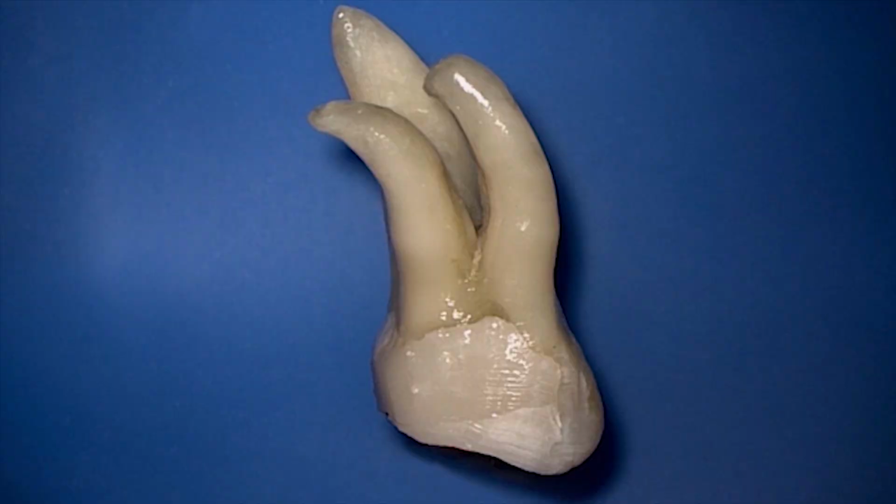Let's take these concepts that we just talked about with glide path management into this maxillary molar. We won't use the SX, which I normally would want to use to pre-enlarge the canal rapidly after the 10, but I recognize not all international colleagues will be using the Shaper X. So if we're just keeping it to a two-file sequence, 10 and ProGlider, let's look at how the 10 and the ProGlider work in this maxillary molar.